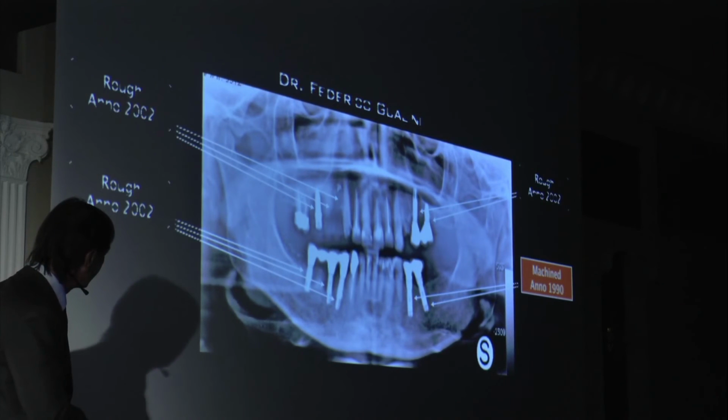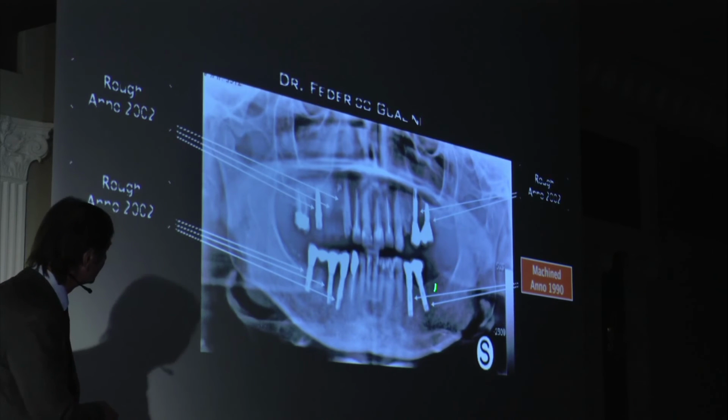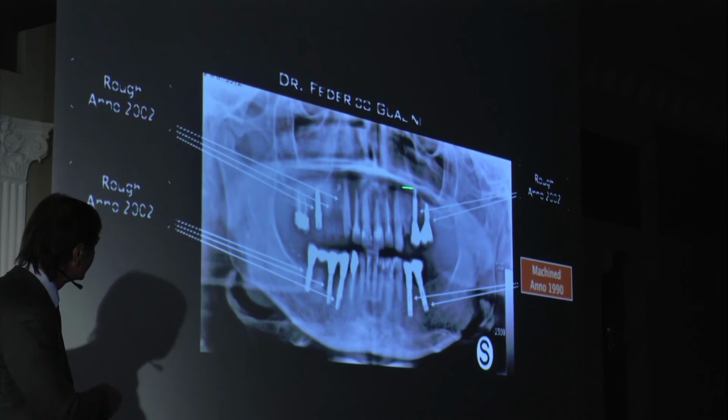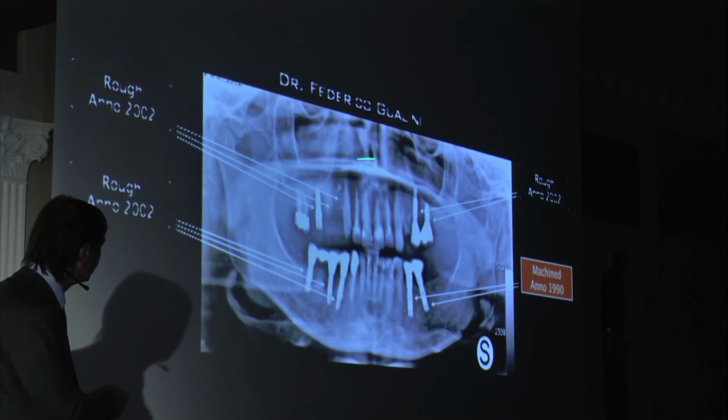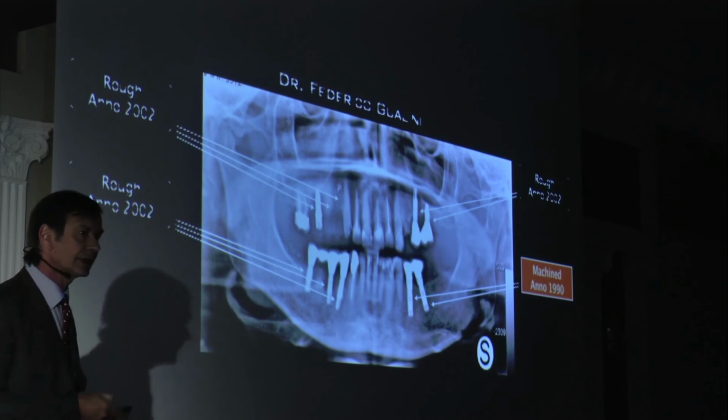Another from Federico Gualini, 1990, 2 machine implants. All these are rough surface, 2002. All failed due to peri-implantitis, and these 2 are still perfect in the mouth.